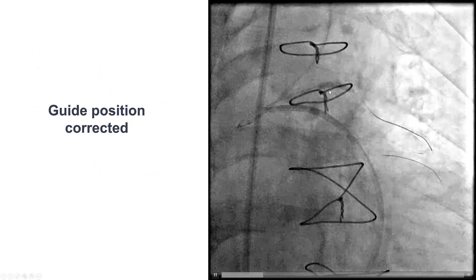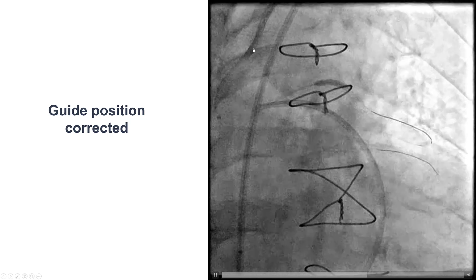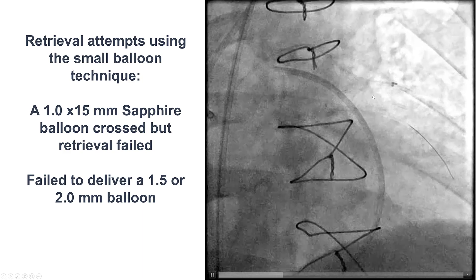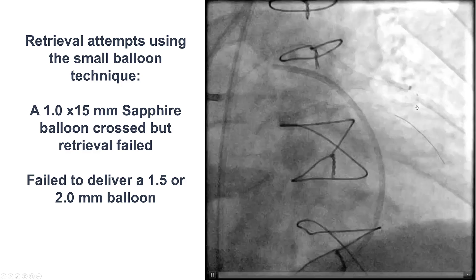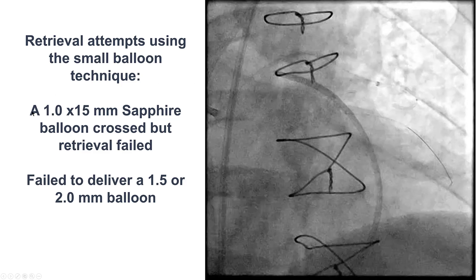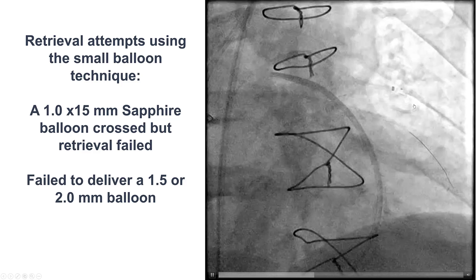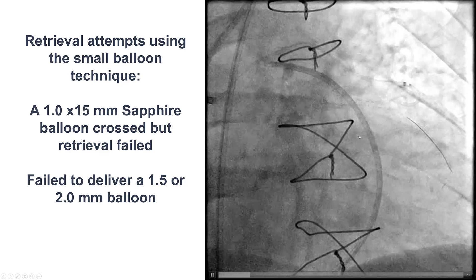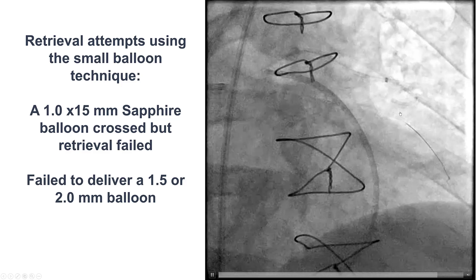We were able to fix this by advancing the balloon into the radial graft, inflating it, and using it as an anchor to re-engage the radial graft. This is an Amplatz Left guide with a 6 French GuideLiner providing better support. We then tried to retrieve the lost stent. We could see it had gone past the distal anastomosis, essentially into the diagonal branch. After multiple attempts, a 1.0 mm Sapphire Pro did cross, but then the stent could not come back — presumably because the stent was significantly deformed. We tried to deliver larger balloons — 1.5 and 2.0 mm — but could not get through the stent, in part because of the significant bend at which the stent was located.